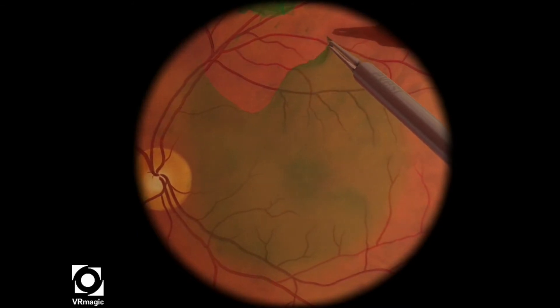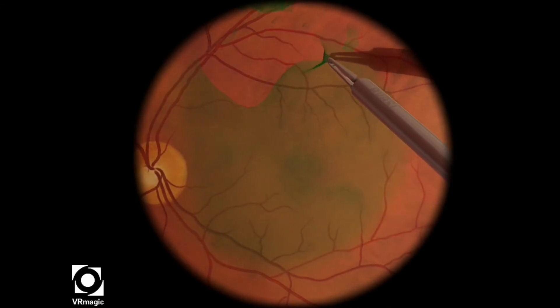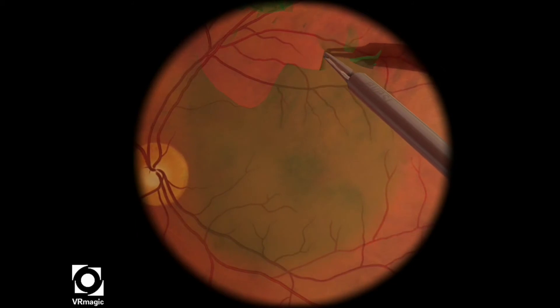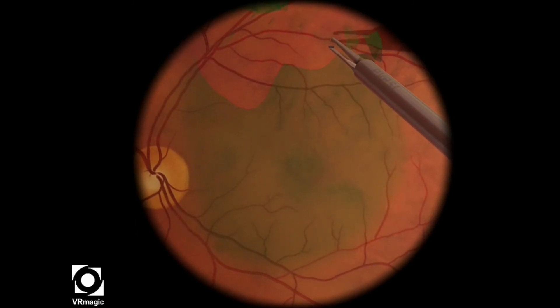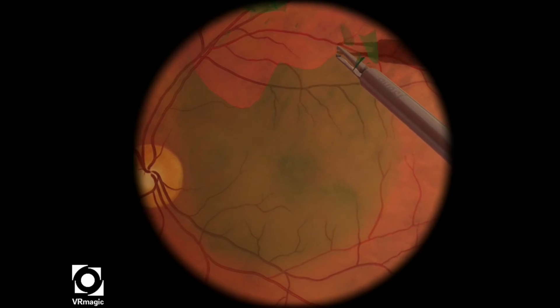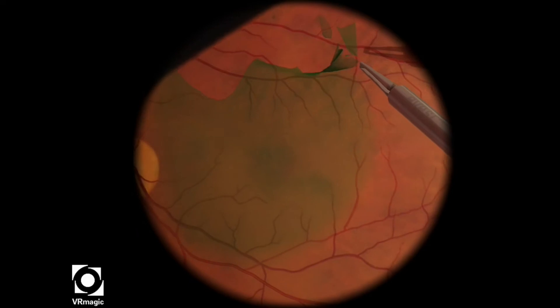This is the area I'd like to choose — somewhere close to the superior arcade and away from the macula. You can tell from this level that the peel is a little more fractured because the tissue really seems to want to come off in small pieces versus large big pieces. But you'll see later on that it is possible to take off a large piece and continue with it, just like a capsulorhexis.